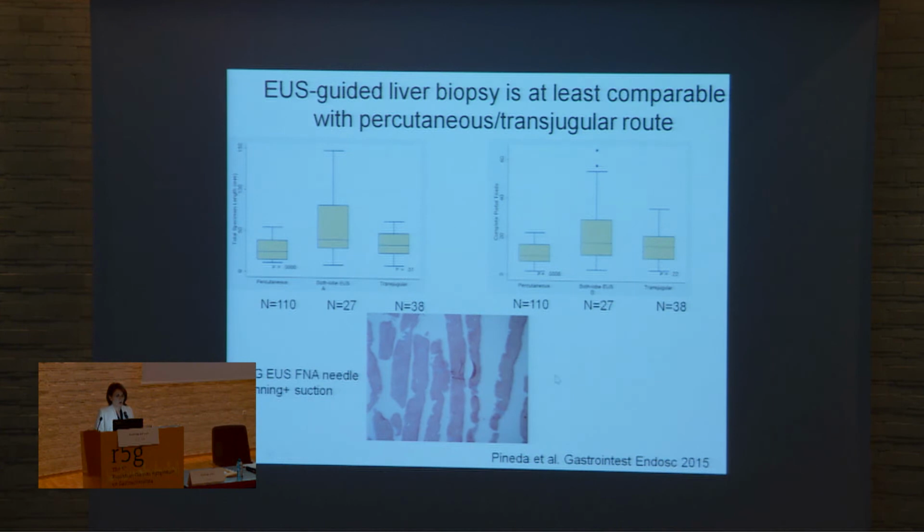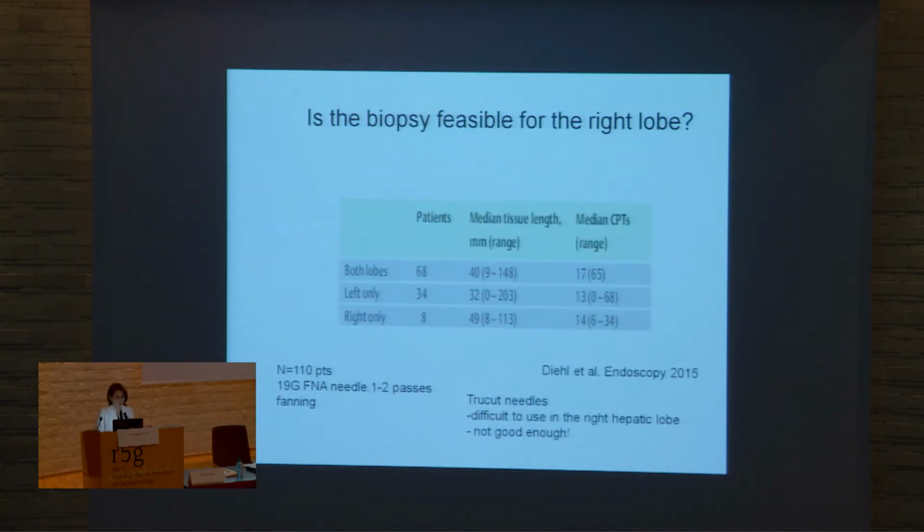approach. Which needle? It's an important task because if we use a 22 gauge needle, this is not enough. Usually it's a 19 gauge needle which can assure enough material.